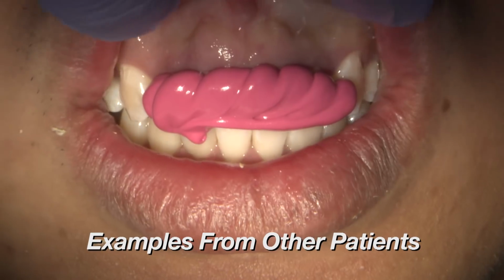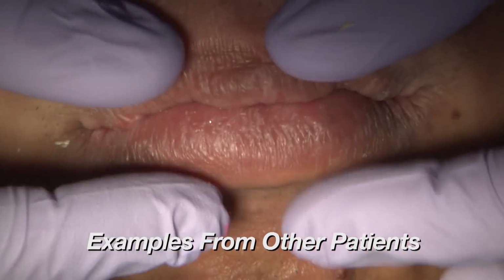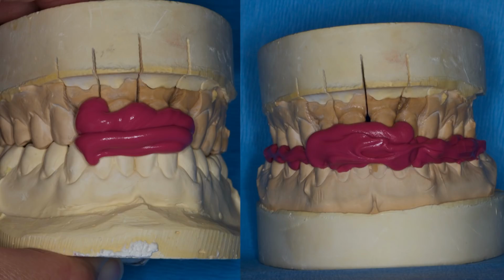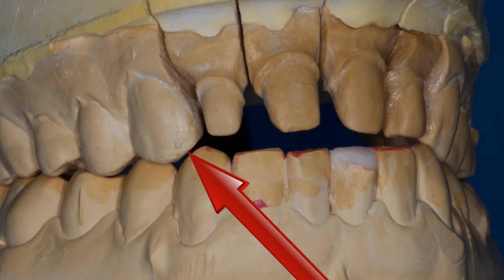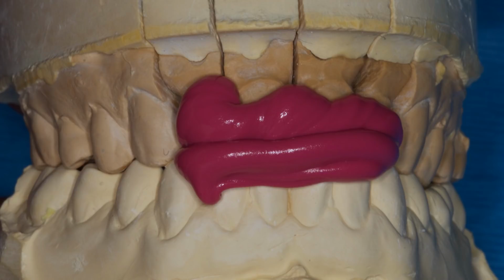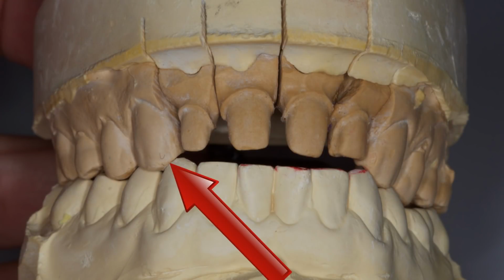If this record is taken with the mandible slightly in a forward position, when the lab articulates the models, it will show a decrease in occlusal clearance. As we can compare in these photos, the models are articulated with the silicone record material placed only on the prepared teeth versus a full arch record. Note how there are spaces between the canines and less incisal clearance for the veneer on number 10. And when the bite is placed only on the prepared teeth, it will allow the patient to more easily locate the MIP, ensuring contact on the canines and more clearance incisally.